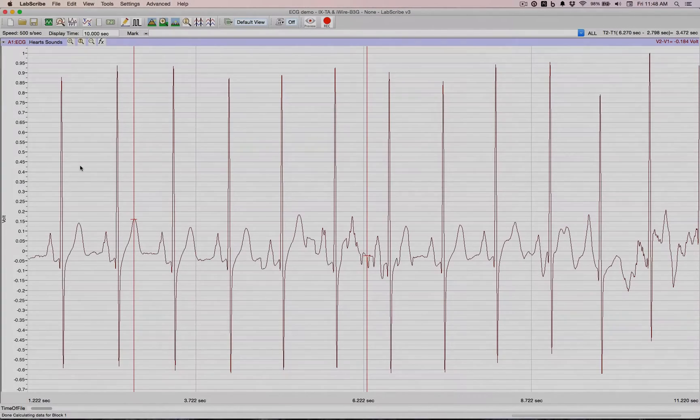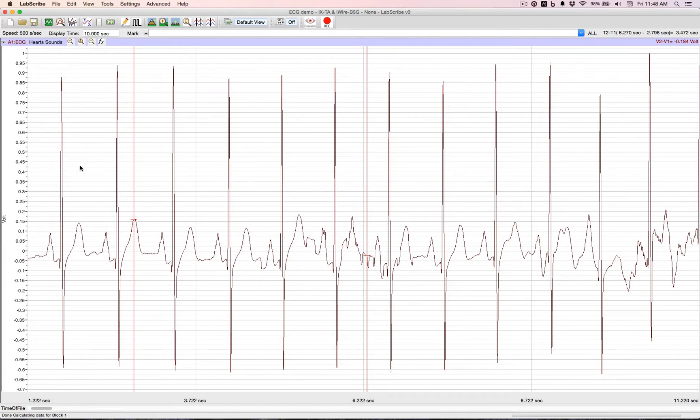In this tutorial, let's discuss performing basic ECG measurements. Here's an ECG trace.